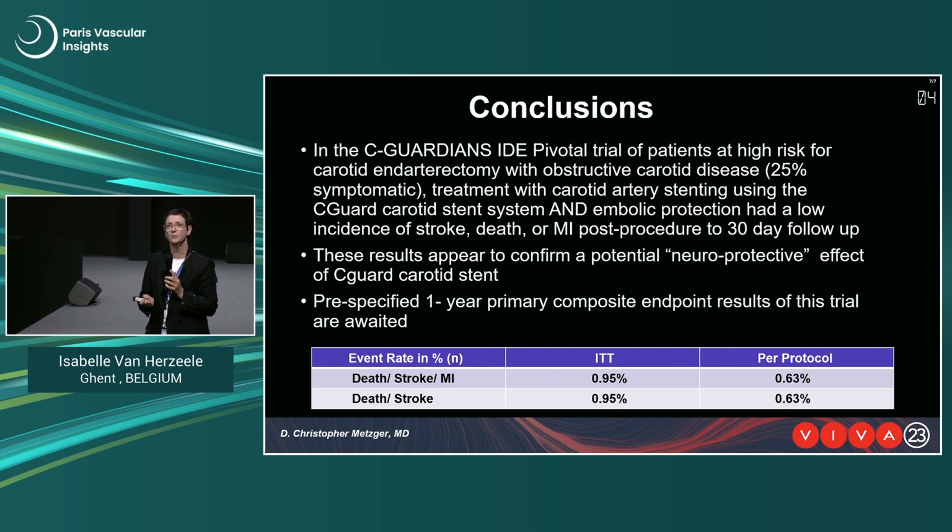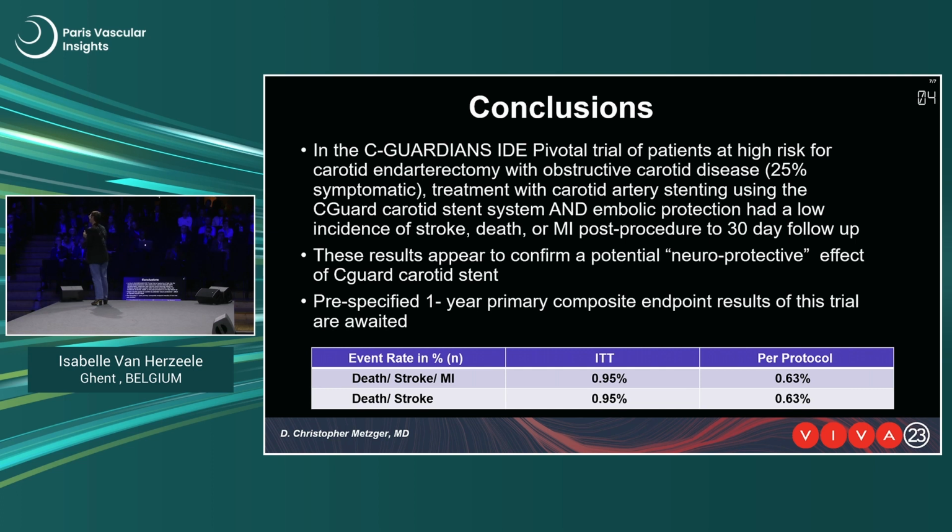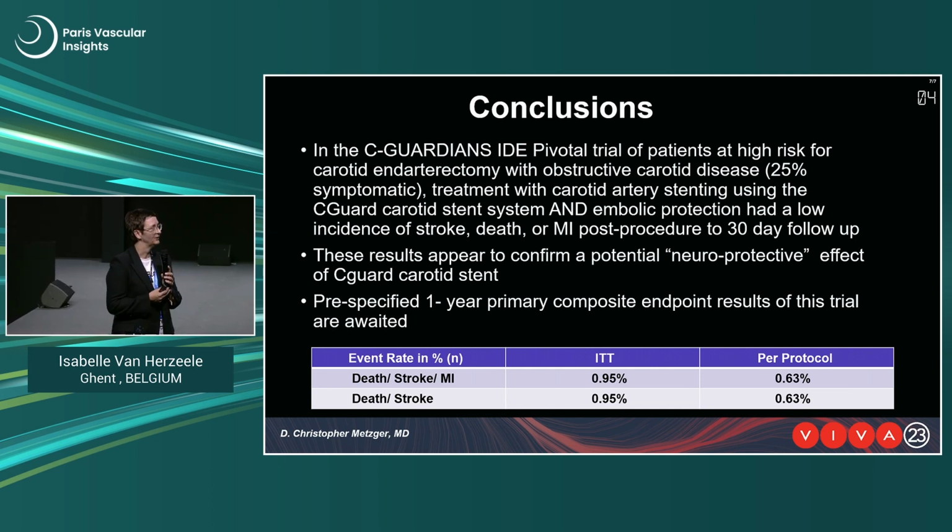And especially if you combine it with proper protection, I think carotid artery stenting, as already mentioned by Richard earlier today, may actually change the practice in the future.